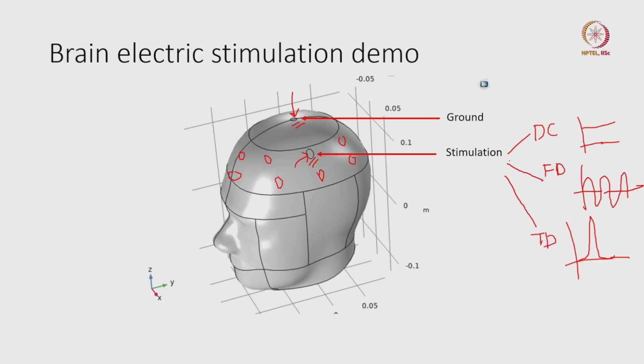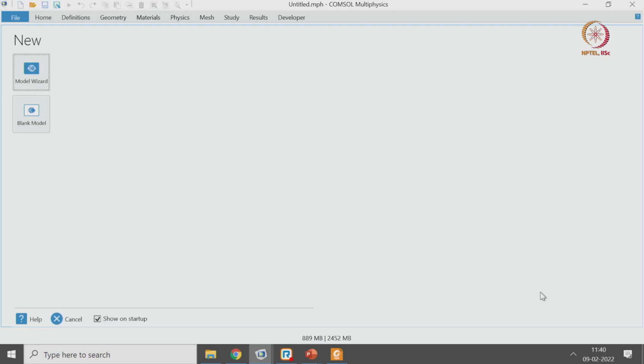Okay, so we are going to start with DC and see how you can do a DC stimulation first, and the approach to the frequency domain and time domain is along similar lines. So let me go and start the simulation.